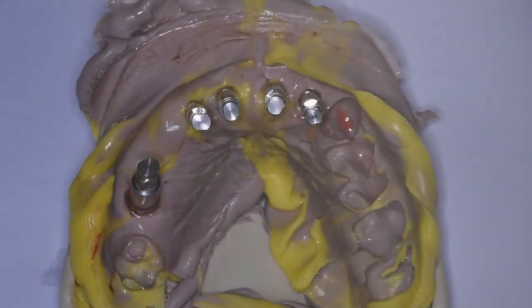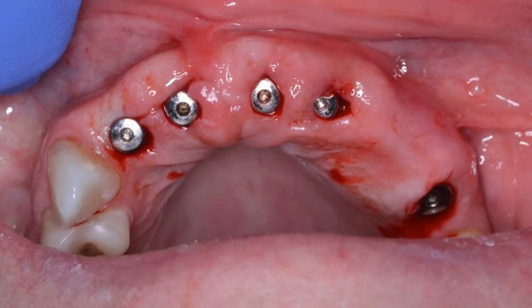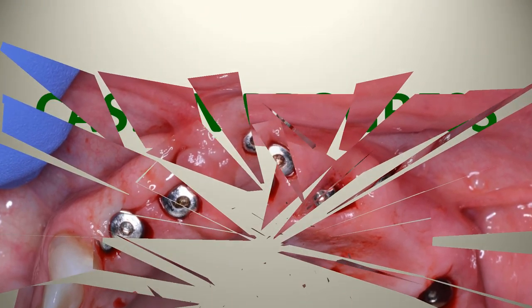And you send that back to the lab and put some healing abutments in place. You can see some healing abutments are put in here. This is after doing the tissue punch in order to access these implants. And so this case is in progress.